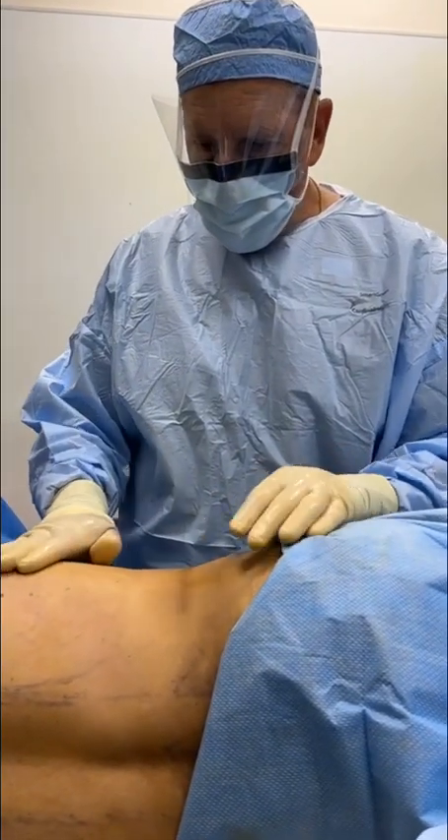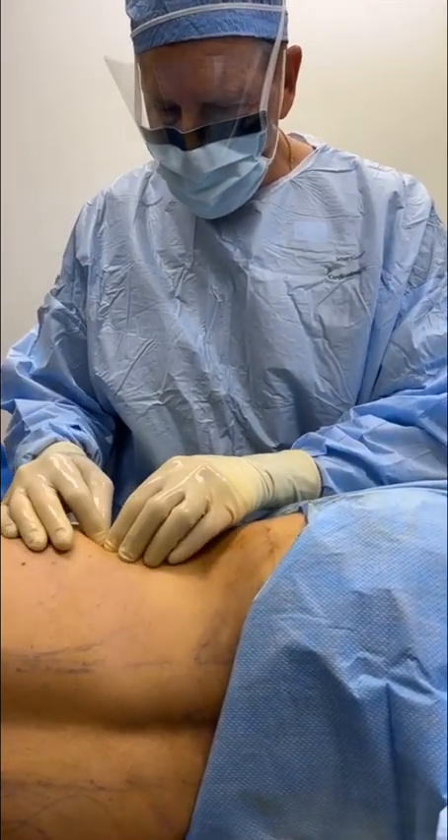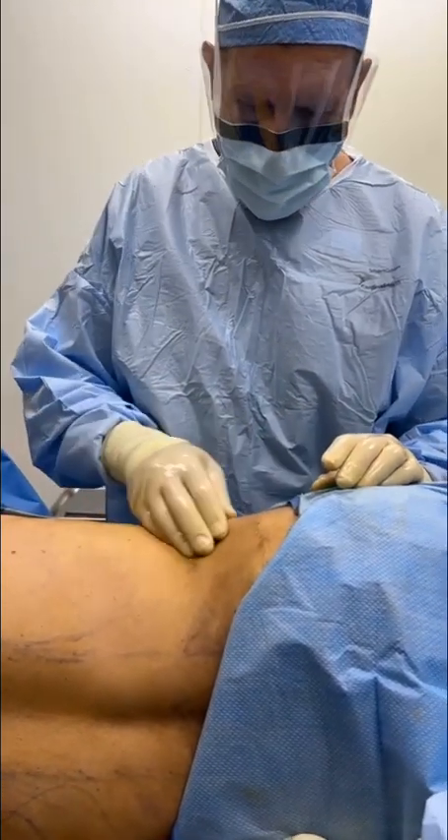Look at that — that's her waist. She's on her side. There is literally no excess fat. This is incredible, but this is already the second time she has nothing.